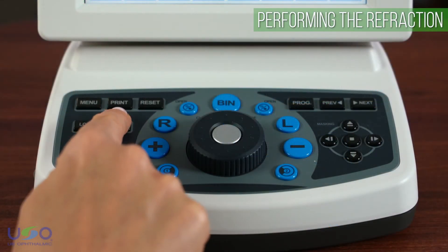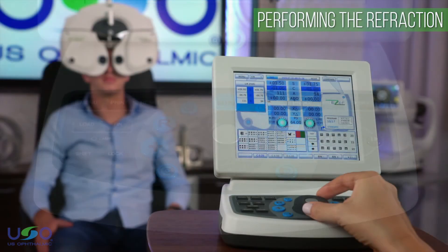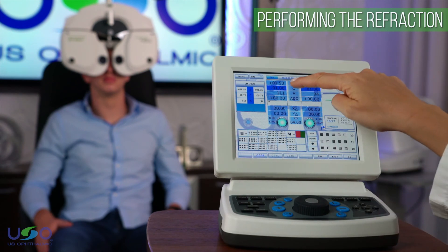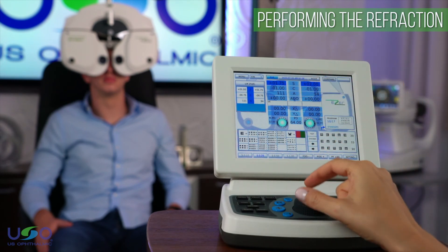This is done by simply pressing Final. Here you can store the new data independently without losing the subjective evaluation of the patient.